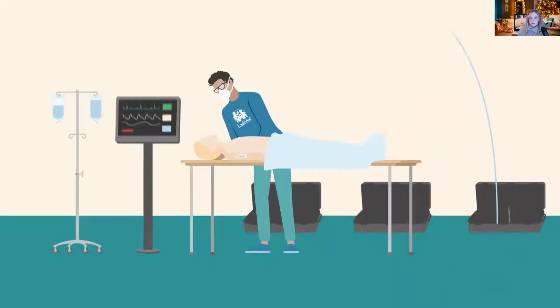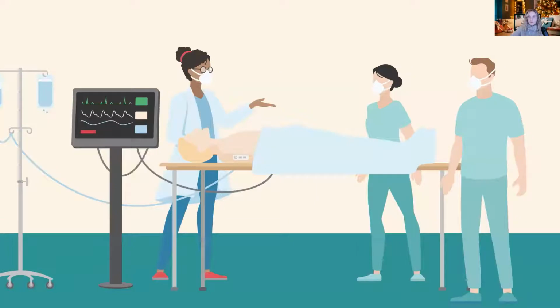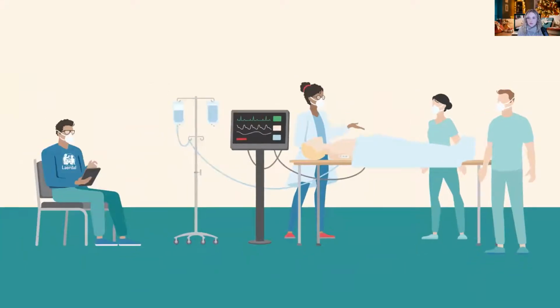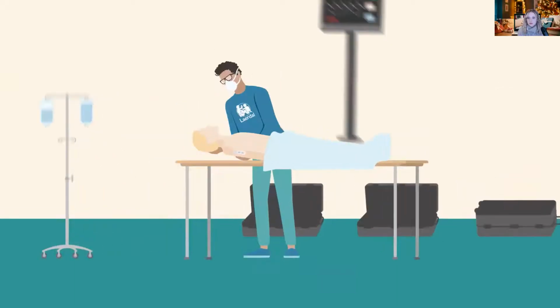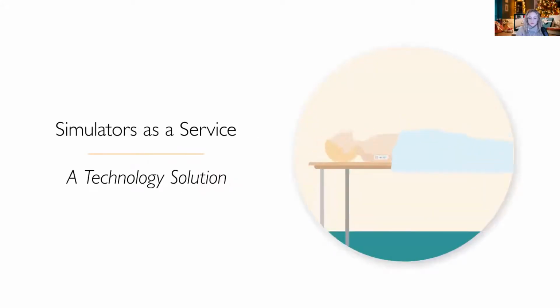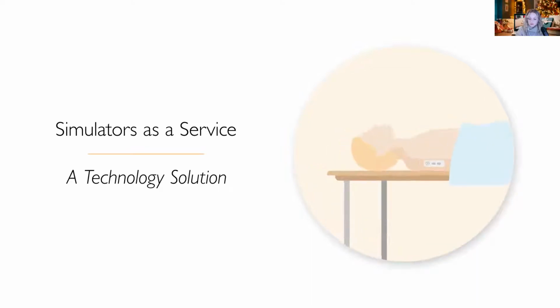With our Managed Services Program, we bring a flexible and sustainable solution that can meet unique training needs to ensure an organization's success. This full-service program can deliver a complete mobile simulation solution, where Laerdal will deliver, unpack, set up, operate, and remove all the equipment needed to facilitate your simulations and even assist in the development and implementation of your content. It is entirely customizable and can bring any combination of simulators as a service, a technology solution that ensures sustainability of equipment. This eliminates the need for dedicated space to store or resources to maintain simulation equipment.